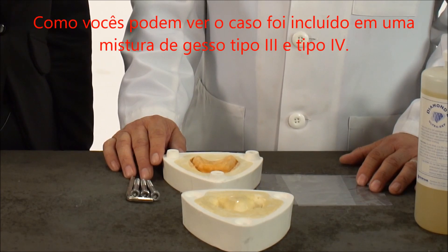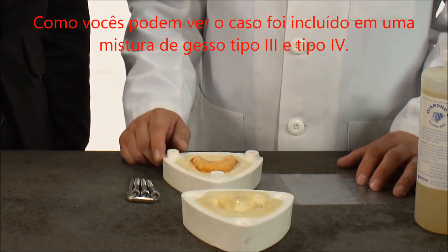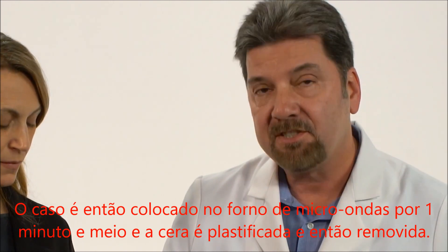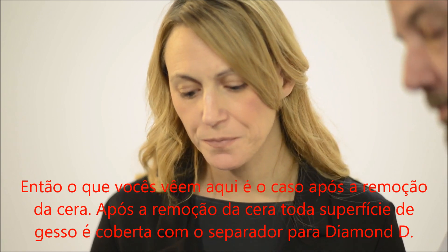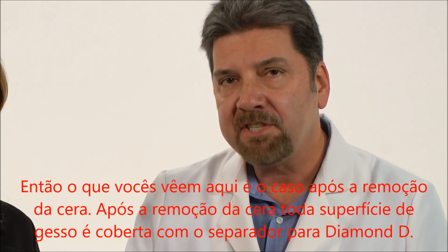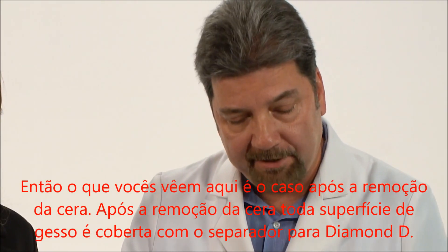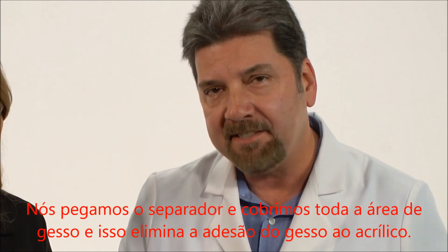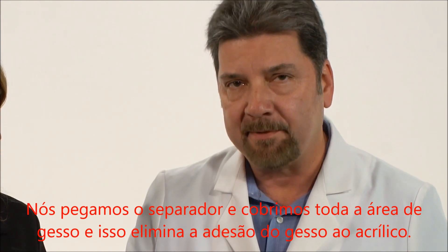As you can see, the case has been invested in a half and half mixture of plaster and stone. The case is then placed in the microwave for a minute and a half, and the wax is softened and then boiled out. What you see here is the case after it's boiled out. After the boil out, all the gypsum areas are coated with Diamond D separator. We coat the entire gypsum area, and this eliminates the sticking of the acrylic to the gypsum.